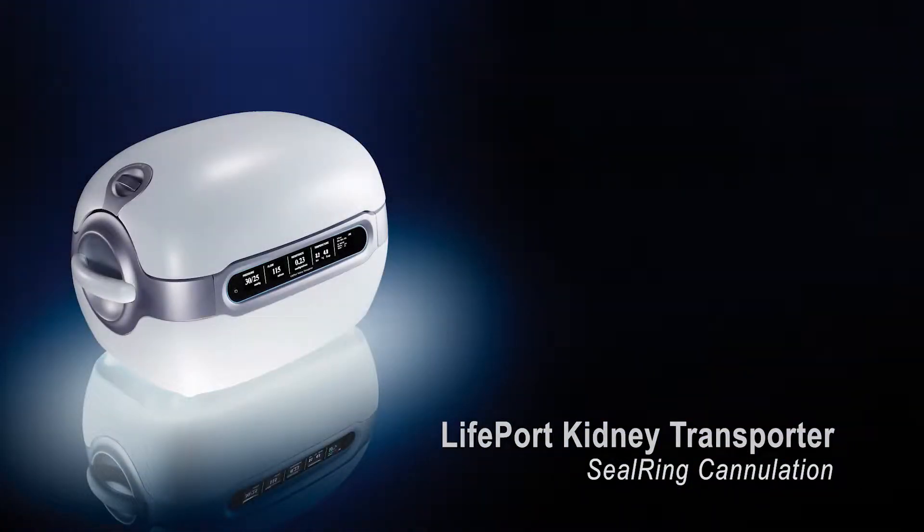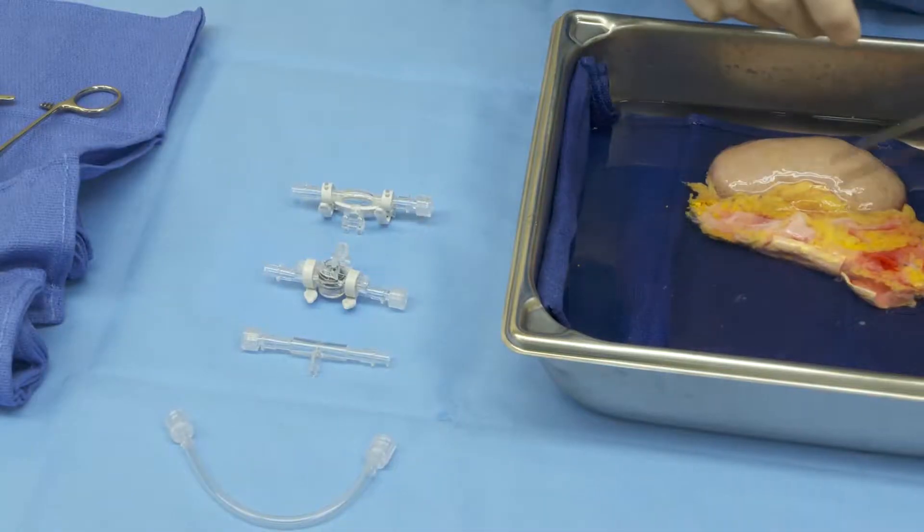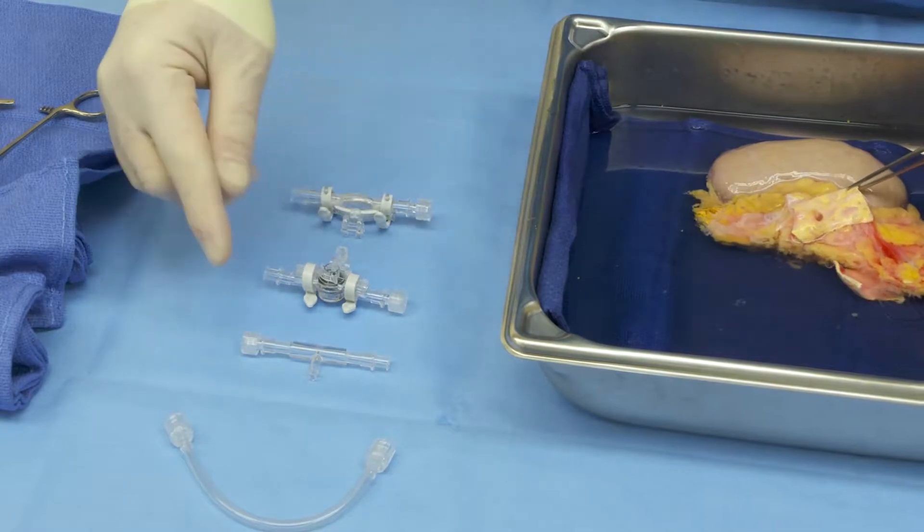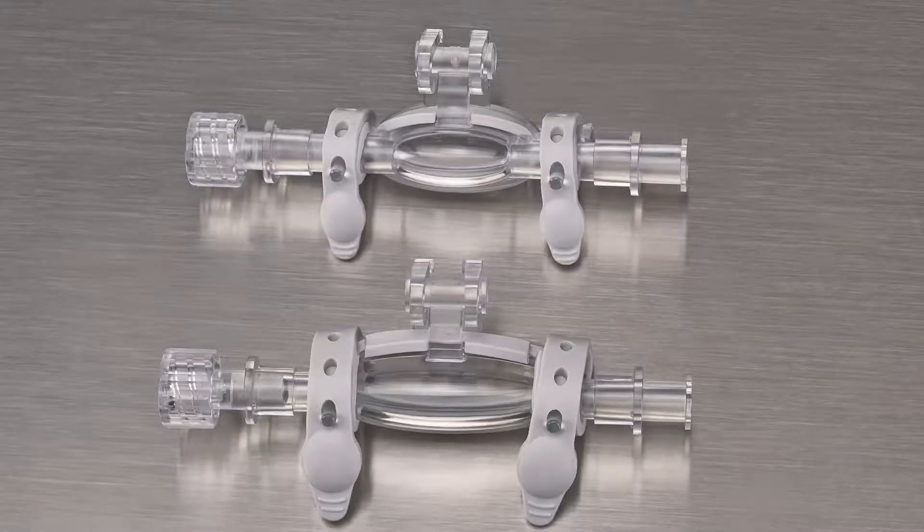Cannulating the kidney with a seal ring cannula. Seal ring cannulas come in two sizes: the 7 by 20 millimeter and the 10 by 35 millimeter. Both cannulas can be used when there's sufficient aortic patch available to create a seal. The 7 by 20 cannula can be used with multiple arteries that are close together to incorporate both into a single cannulation. The 10 by 35 can be used in the same manner with arteries that are spread a little further apart.